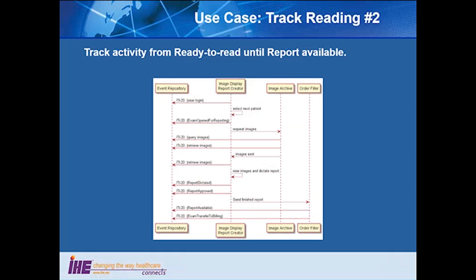Also looked at, once you've got a study, defined events for the activities that go from it's ready to read until the report is available. Here it'd be an image display, report creator, archive, order filler are likely candidates. And again, we defined events like exam open for reporting, report dictated, report available, and so forth.